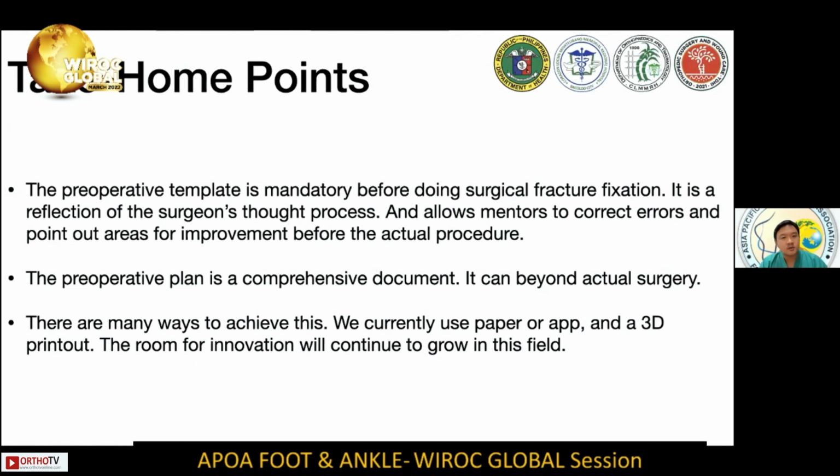It goes beyond actual surgery, hence the rehabilitation that you have to include for your patients, not just patient positioning, anesthesia type, marking, etc. Finally, there are many ways to do your pre-op templating. I'm not saying that there's a best method of doing so. You can use paper, you can use an app, you can use a 3D printout, and there's really room for innovation. And I hope that this field will continue to grow.